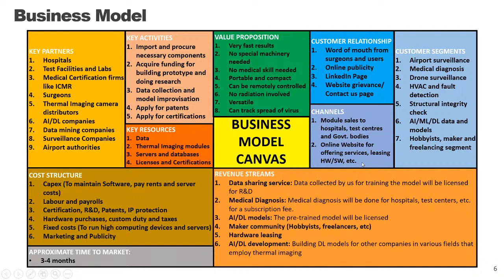The channels are module sales to hospitals and government bodies, and online websites that will offer our hardware services and software services. Our customers will include people from many domains once the device is developed. Right now we are focusing on medical diagnosis. Afterwards we might also extend to other areas.